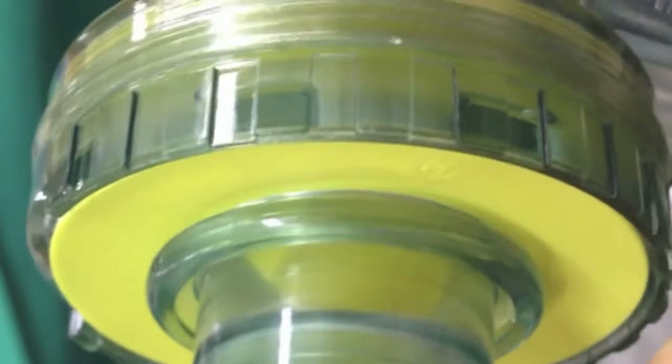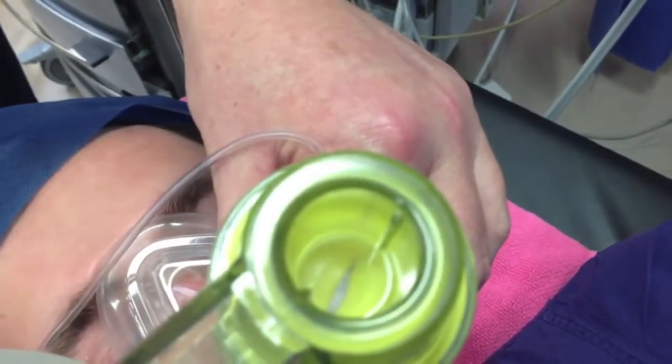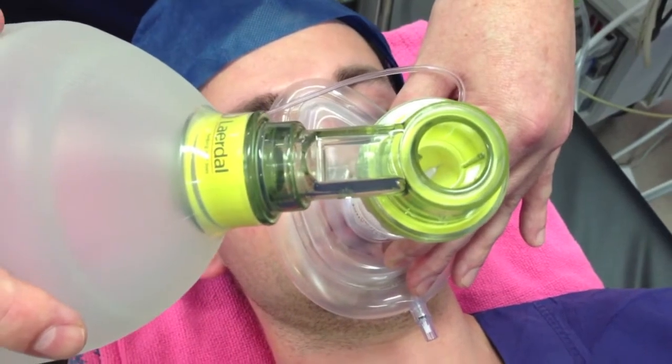In this spontaneously breathing subject, this valve can be seen opening during expiration and closing during inspiration. Closure of the valve during inspiration prevents entrainment of room air, which allows the spontaneously breathing patient to generate a sufficient negative pressure within the mask to open the duckbill inspiratory valve. High concentration oxygen can then flow from the bag and reservoir to the patient without being diluted by ambient air.